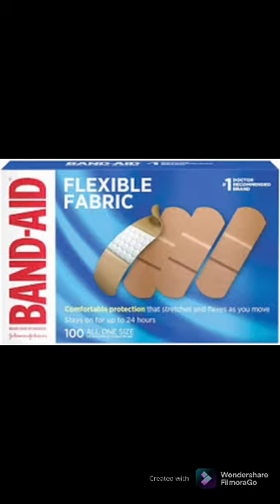Dispose of used and contaminated material. Thank the guardian or parent. Remove gloves, sanitize your hands, and transport the specimen to the laboratory.